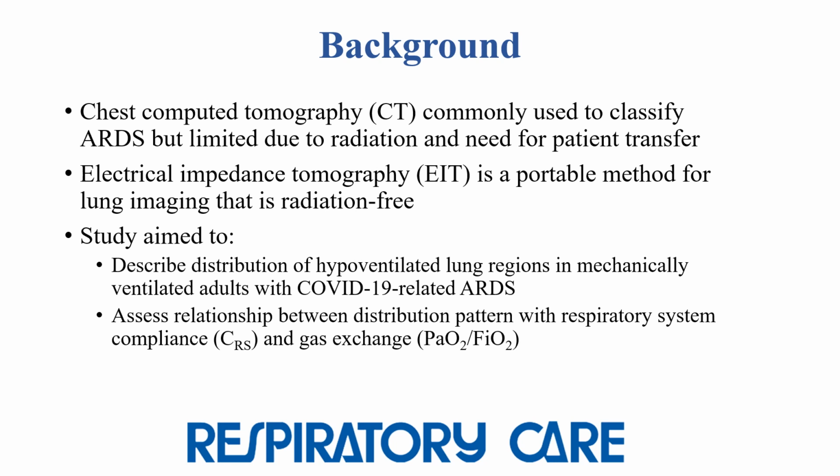A chest CT is often used to classify ARDS, but its use is limited due to radiation and the need for patient transfer, and this makes it challenging in patients undergoing invasive mechanical ventilation. EIT is a portable method for lung imaging that does not use radiation and allows for monitoring distribution of ventilation in real time. The aim of this study was to describe the distribution of hypoventilated lung regions in adults who were mechanically ventilated and had COVID-19 related ARDS.